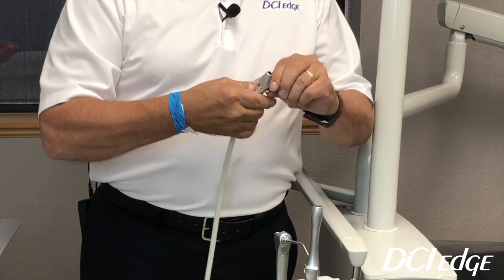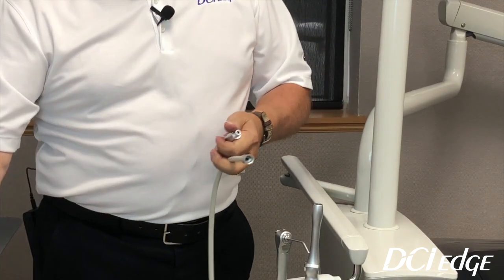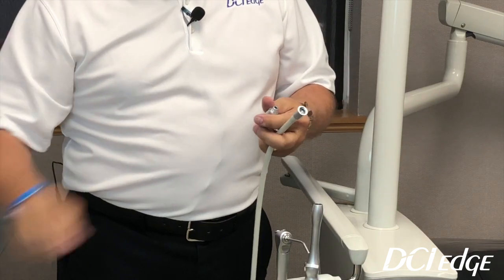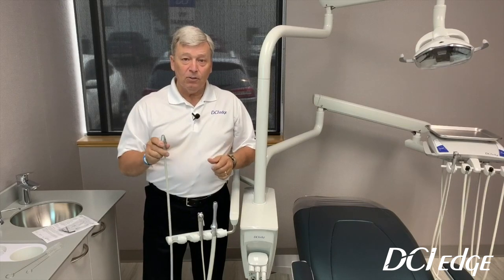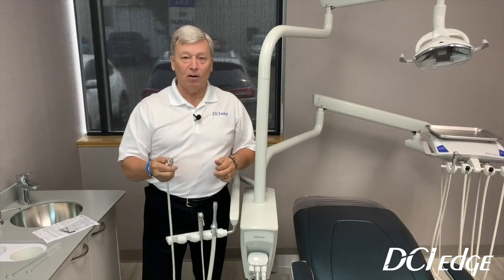It will be the same process for the saliva ejector. Push the barrel out, disconnect it from the hose, use the smaller bottle brush, run it up and down through the barrel, and then re-snap everything back together. If you do this once a week, I guarantee you these will last a lot longer and will be a lot easier to turn on and off.